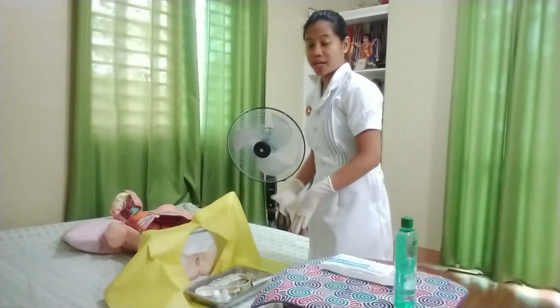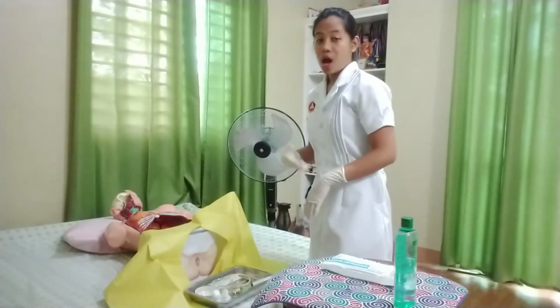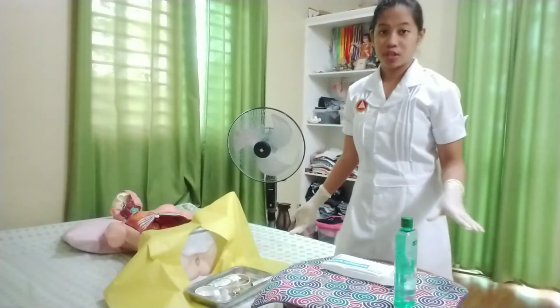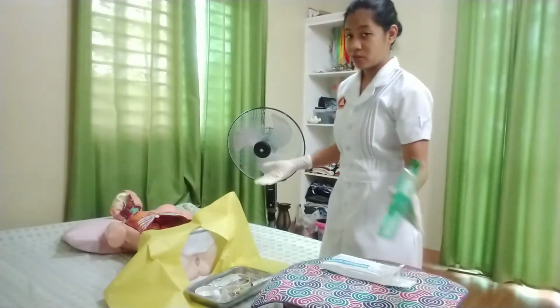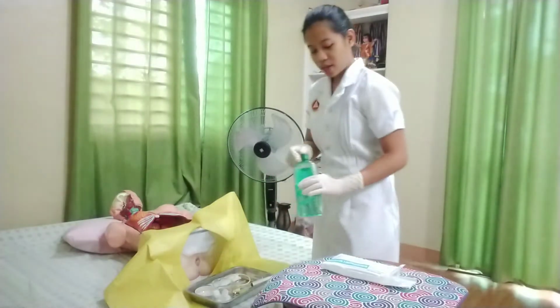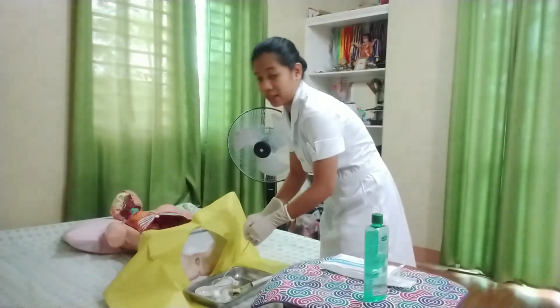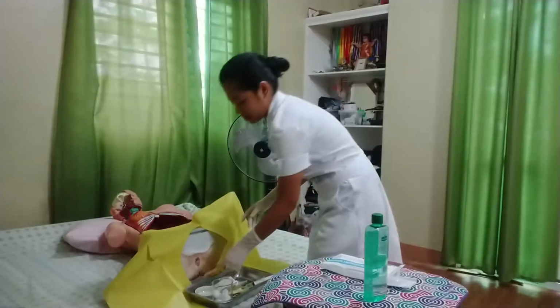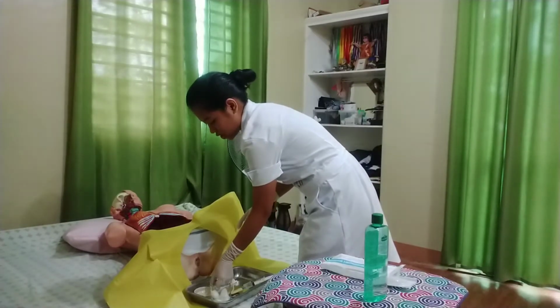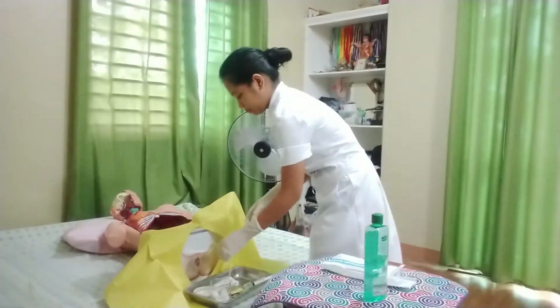So after checking if the balloon of the catheter is inflating appropriately, we will pour an antiseptic solution onto the cotton balls. So assuming that this is an antiseptic solution, we will pour it. And then we will also lubricate the tip of the catheter about 1 to 2 inches. This is to help us insert the tip of the catheter smoothly and easily.